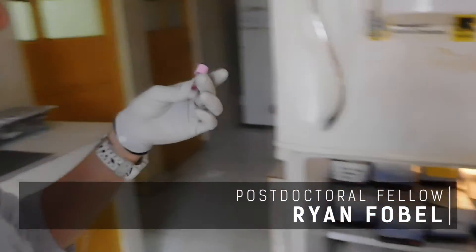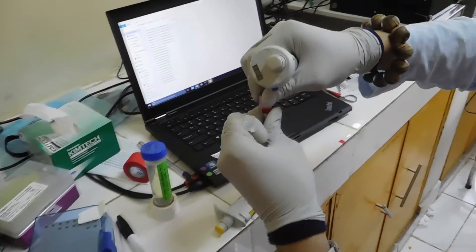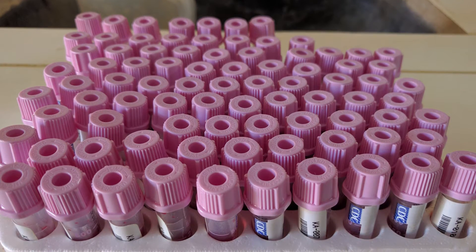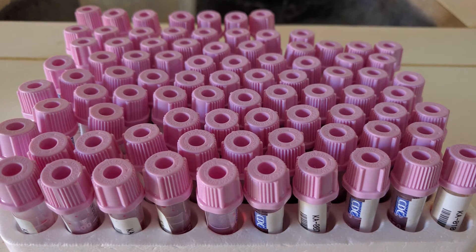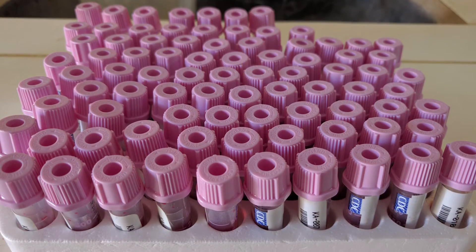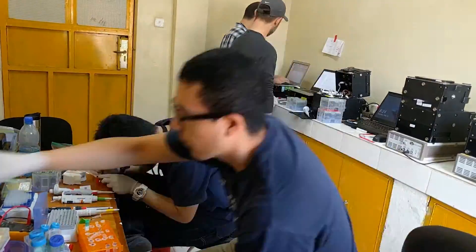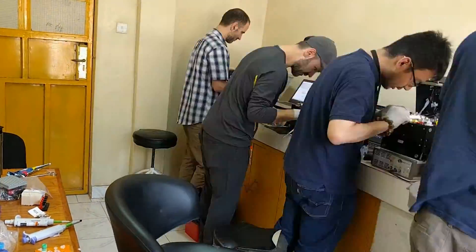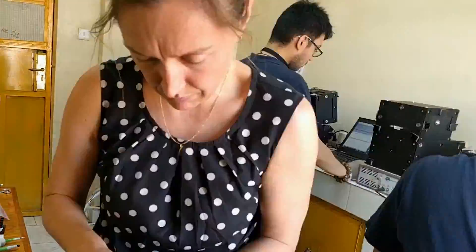Over the course of the three weeks that we were there, we had blood samples from caregivers and also from children who were being vaccinated at the time — 75 samples from children receiving vaccinations and 75 from caregivers. We were taking these blood samples and testing them with our system to measure the antibody levels for both measles and rubella, and the two different types of antibodies: IgG and IgM.